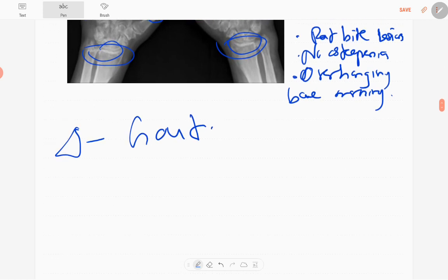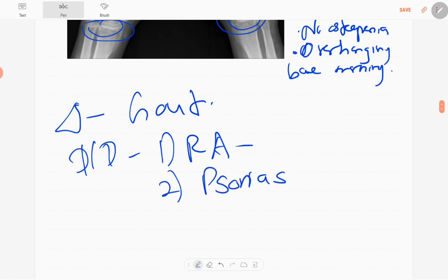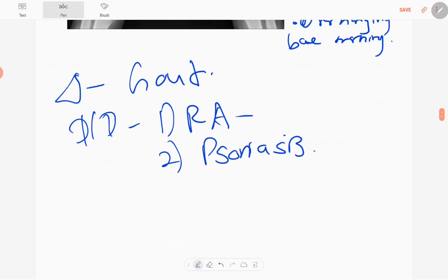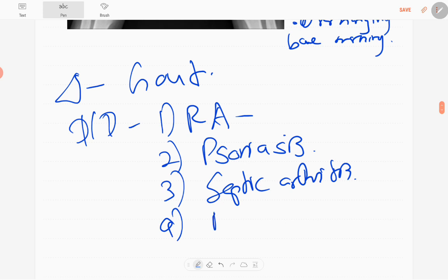The differential diagnoses include rheumatoid arthritis and psoriatic arthritis. If there is involvement of a single joint, you can think of septic arthritis — for example, the first metacarpophalangeal joint. You can also consider reactive arthritis. Those are a few differential diagnoses.